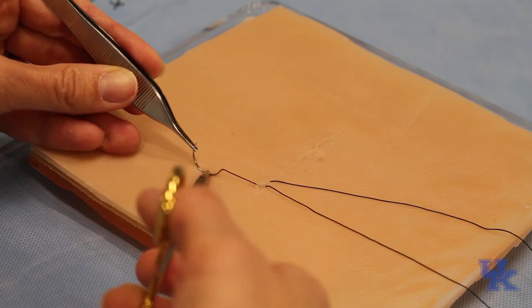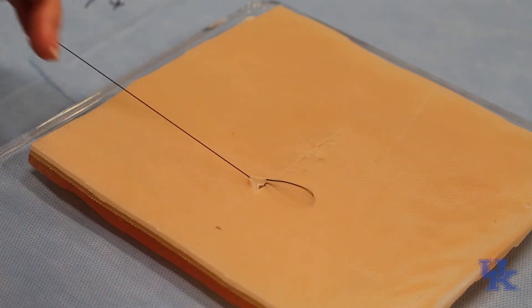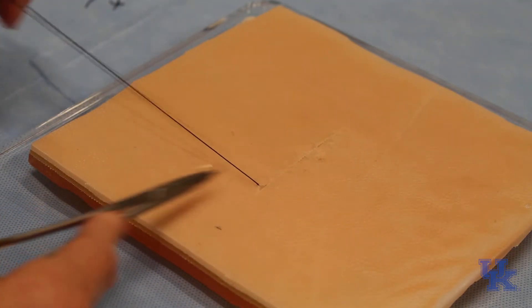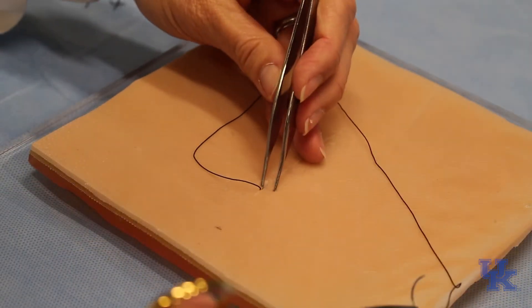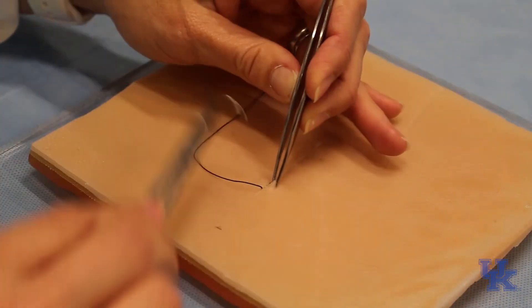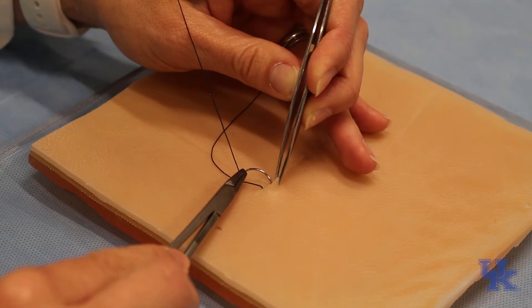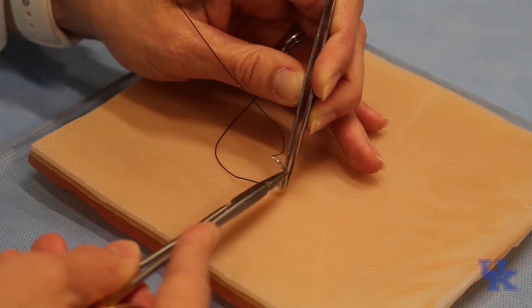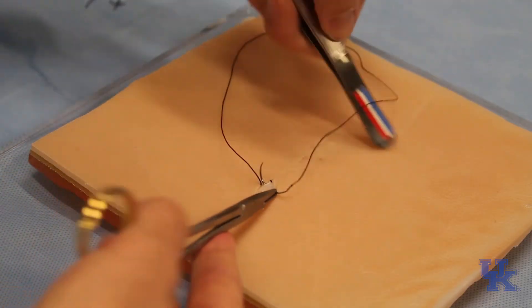At this point you have this coming out superficial. Everything's superficial. We want our knot to be deep, so I'm going to come over here and pretend like we're doing the second half of that buried suture. You're going to come in just below the skin edge. You're going to come out deep in the wound.